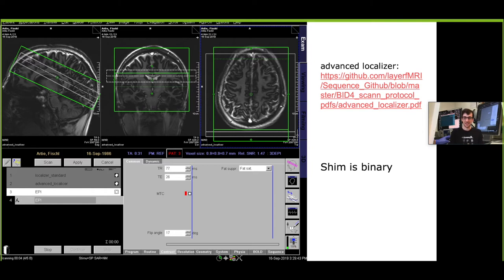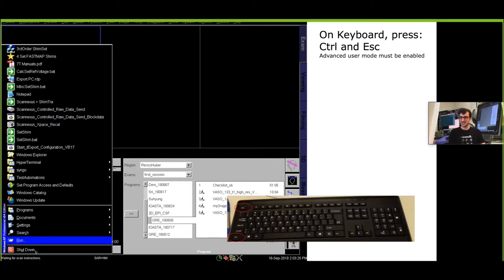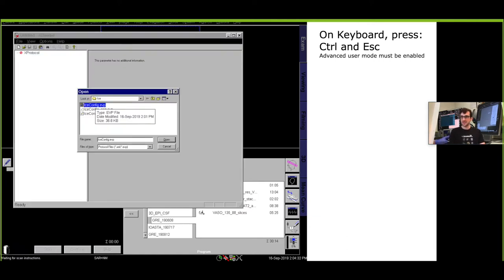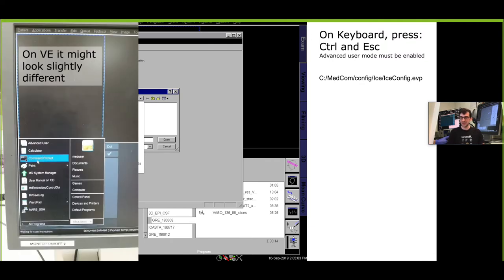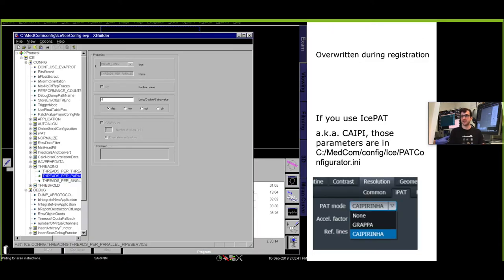Then after I did the shimming I usually change quite a few parameters on the reconstruction side. On Siemens when you press the Ctrl Escape key you have this Windows XP window and then you can select run and execute the program X Builder. This gives you this little editor where you can select any files, for example here the one in MedCom Config Ice Config EVP. This looks slightly different on the new Terra platform or VE scanners. There you would again use the Control Escape shortcut key and then select the command prompt and just type in X Builder which gives you then the same kind of editor.